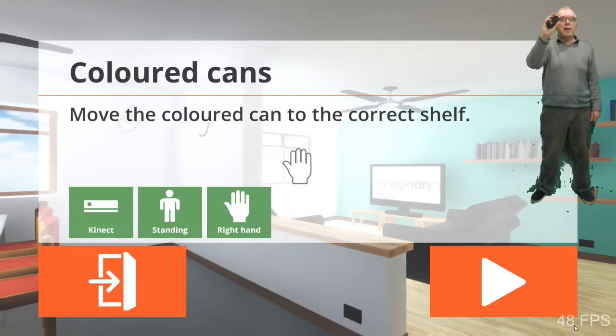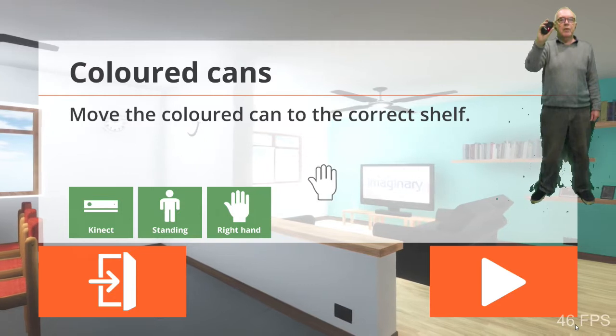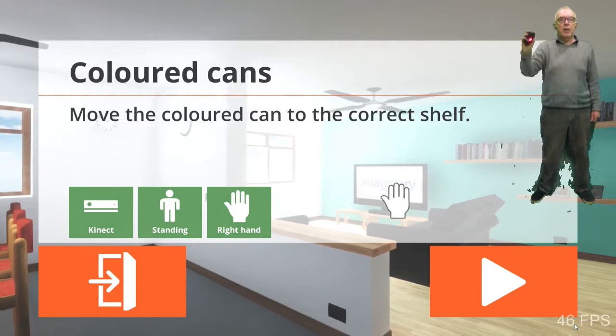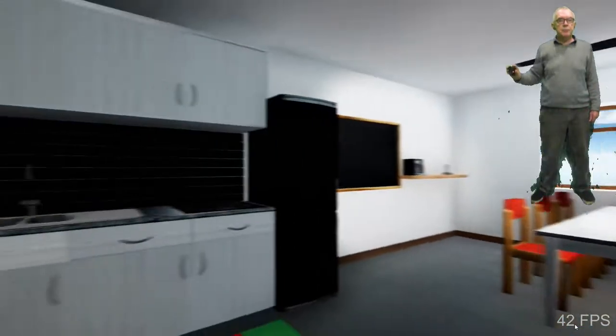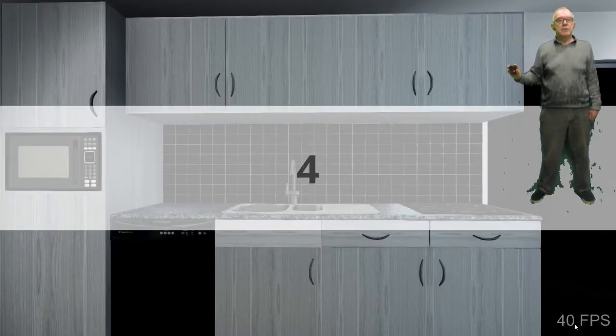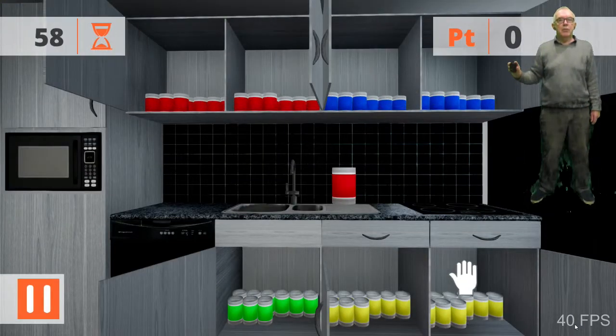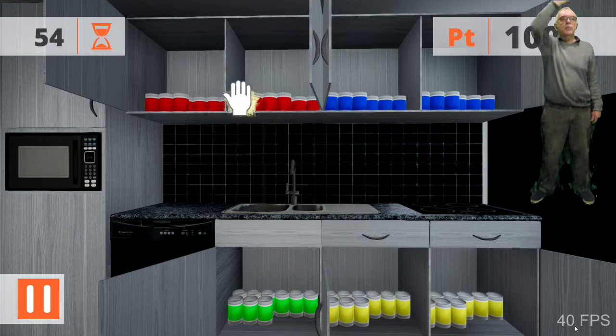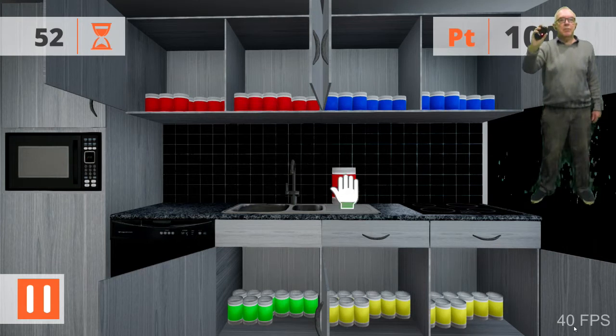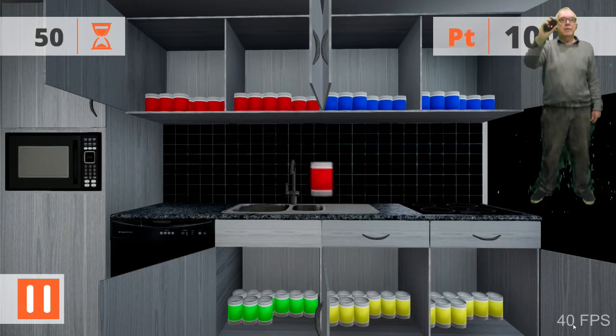It tells me what I have to do. I've got to move the coloured can to the correct shelf. I'm ready to play now. So it takes me into the kitchen, and I've got to recognise the colour of the can and move it to the correct shelf. Okay, so we start with a red can. I select it, move my arm up so that it's in the correct shelf, another red can, up.